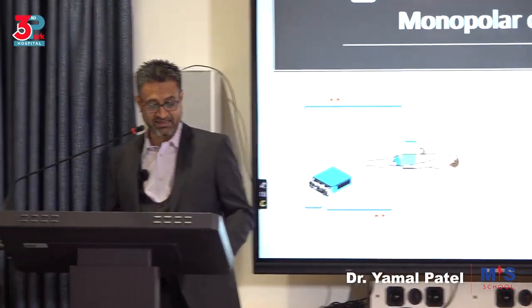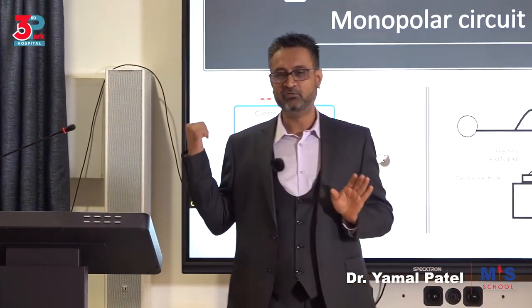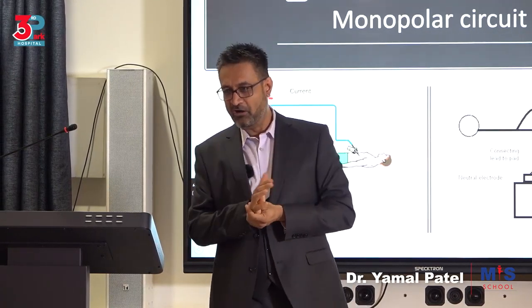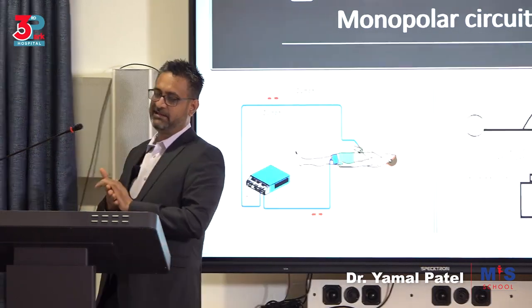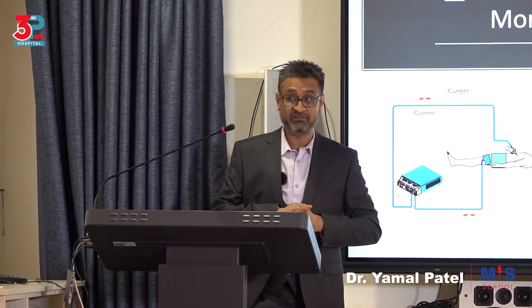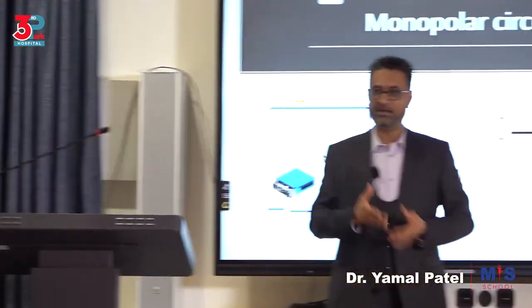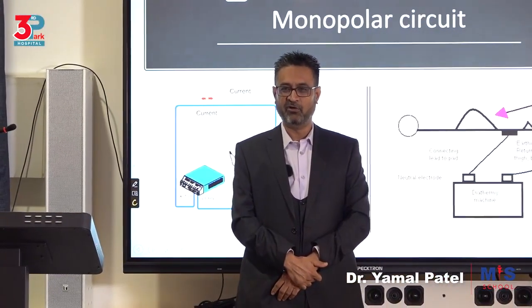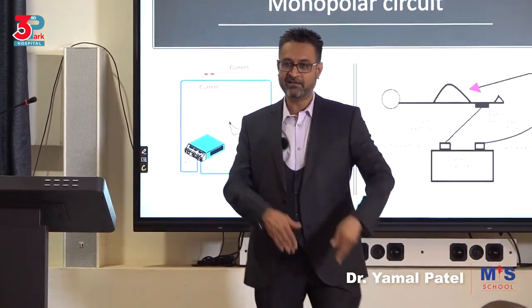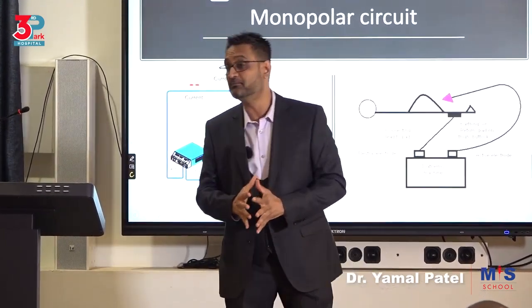Unless you know energy, don't use it. This is one of the most dangerous pieces of equipment to play with in an abdomen if you don't know how to use it. I take lots of classes on energy because this is very poorly understood and not covered in classes when we are doing post-graduation. And then the day you're out there, you're expected to start using it. All people know is blue and yellow: blue to coag, yellow to cut. I tell them no, that is absolute nonsense. That is not how it's supposed to be worked with.